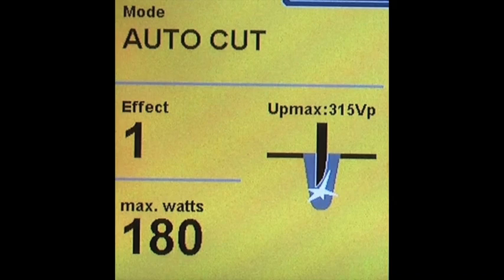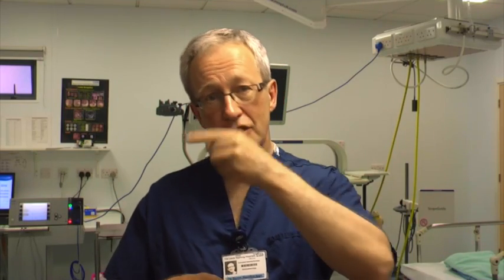Erbe also has a setting called auto cut, which behaves to my mind identically to dry cut — I don't actually know a single instance where they recommend auto cut over dry cut. Personally, unless you're a very seasoned expert, I'd forget about auto cut and dry cut and remember EndoCut I for the circumferential incision.